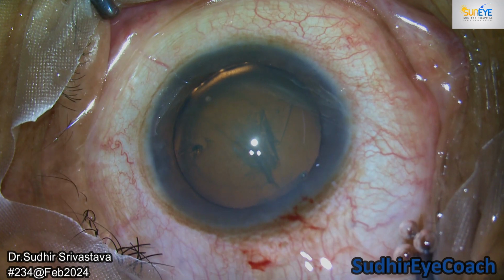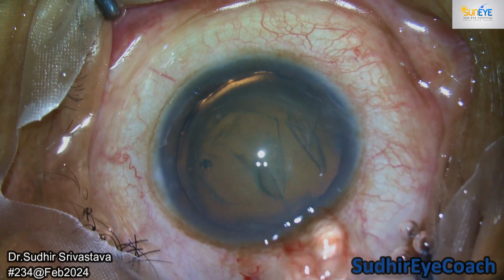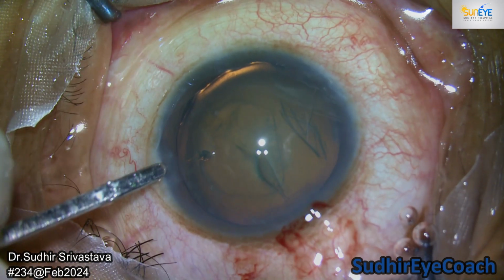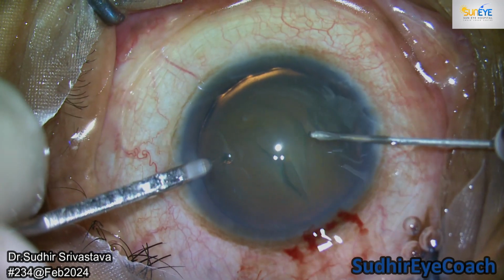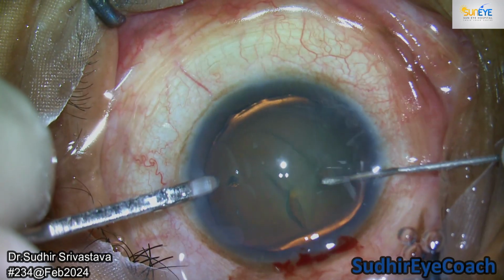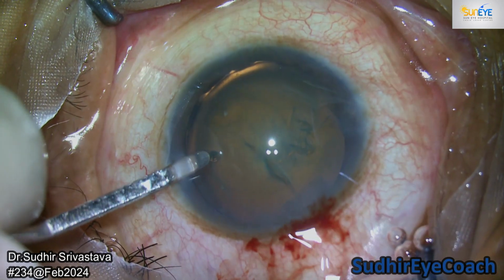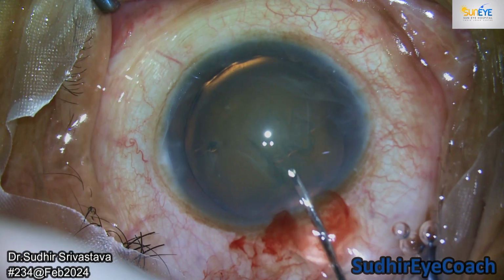Then I again started the capsulorhexis, and always fill the chamber with viscoelastic, so that at least you can give proper tamponade to the vitreous, because in the area of exposure, in initial cases, if the vitreous comes, then it is very difficult to continue the surgery. So I completed the capsulorhexis.